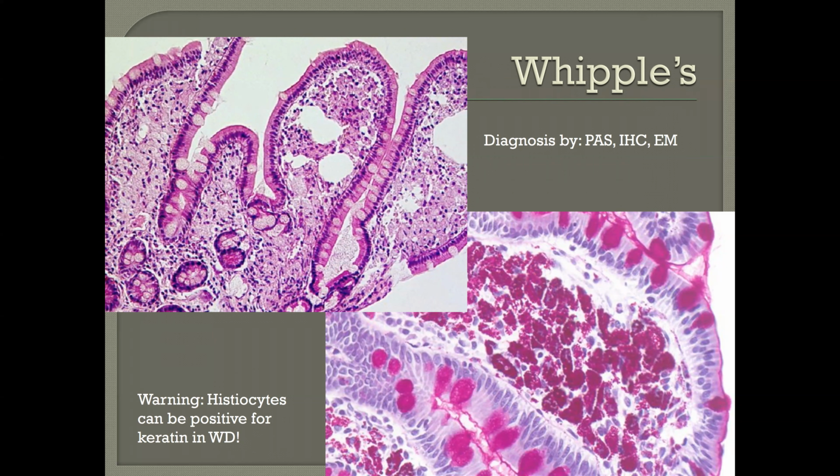One caveat here is that because there are cell debris products in these histiocytes, they can sometimes stain positively for pancytokeratins or other cytokeratins, potentially leading to a misdiagnosis of signet ring cell or diffuse type carcinomas.